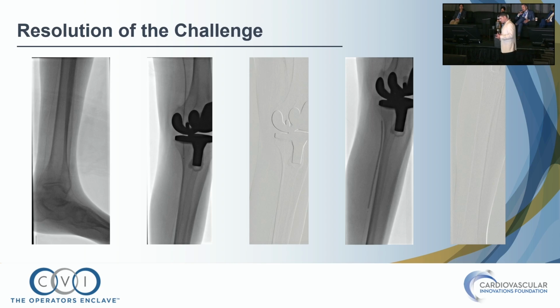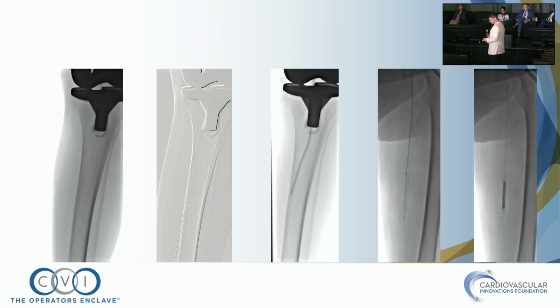And I have no relationship with Abbott, but I like their new device, Jeti, and the reason for that is I truly feel it combines two actions, not just the aspiration mechanism, but also fragmentation of the clot using this high pressure saline jet inside the catheter. I feel like sometimes it does a job. So here, you see my Command wire all the way down to the PT. And here in the left side panel, in the second one from the left, you see the Jeti catheter. And the video didn't play, let me see.